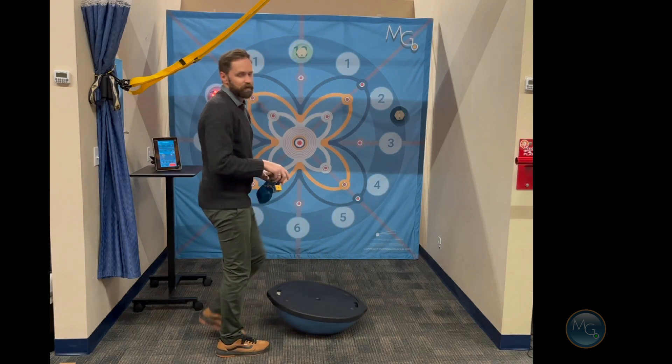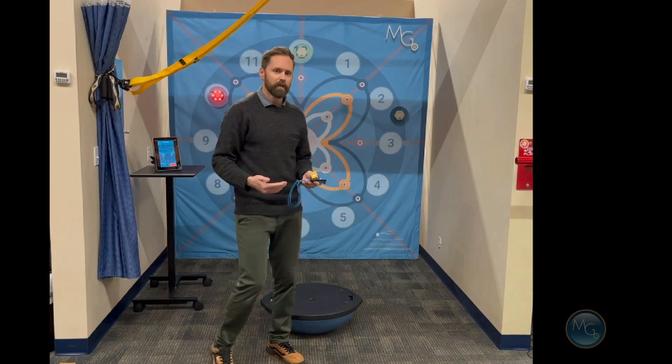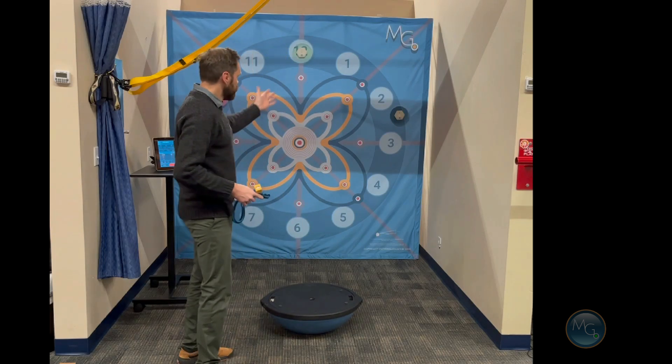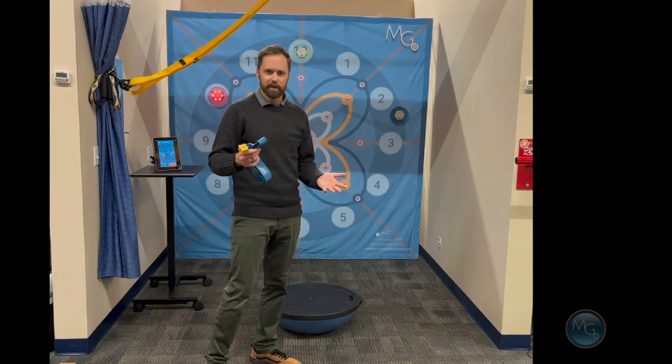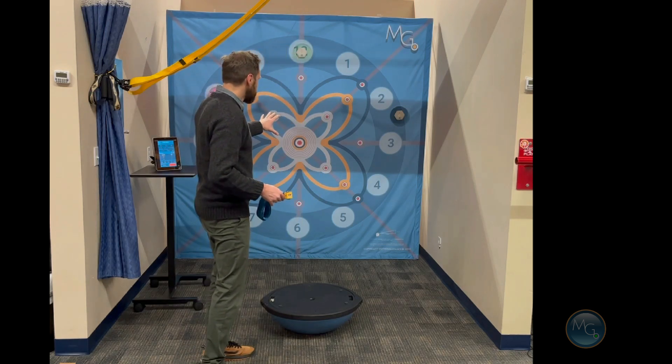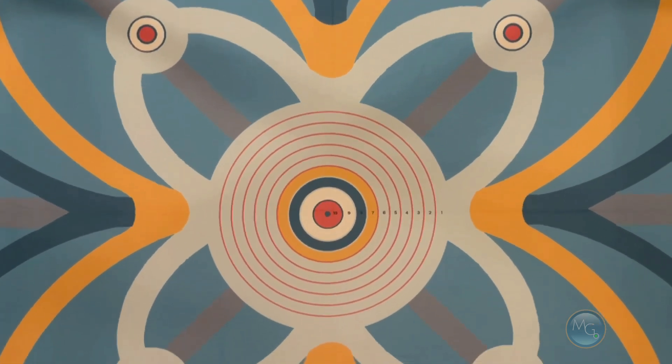As you can see, there are tons of different ways you can get really interactive using this — with either the standard laser pointer, doing motion guidance trapping, or with the interactive system. The background also has the center target here, which is standardized for joint positional error testing.